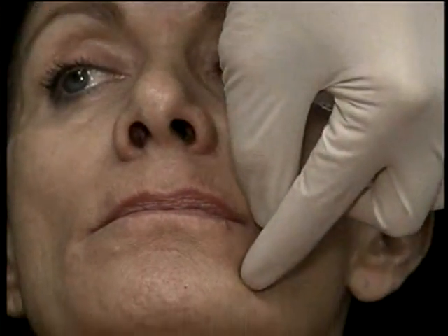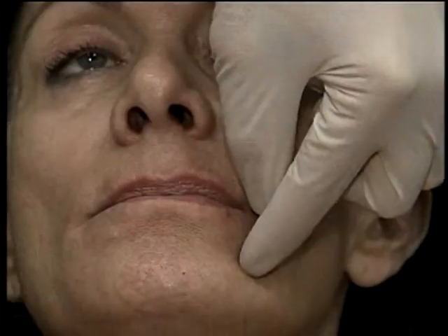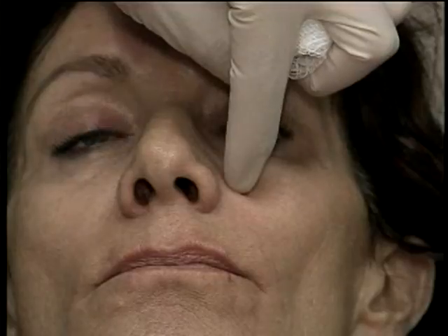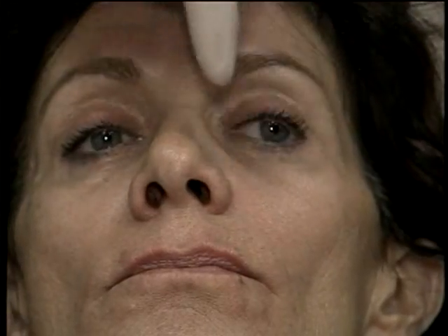Follow that tangent down to where the mental nerve is. And the supraorbital nerve is in this region. But I want to have that infraorbital nerve anesthetized and the mental nerve anesthetized. So I'm looking to treat those areas. I don't want to inject the foramen directly, but I want to inject near the foramen in order to get a complete nerve block. If this is appropriately anesthetized, then the whole upper third of the lip will be numb.